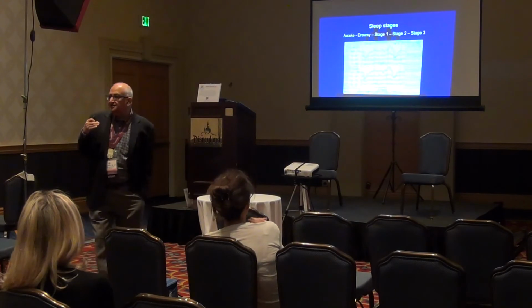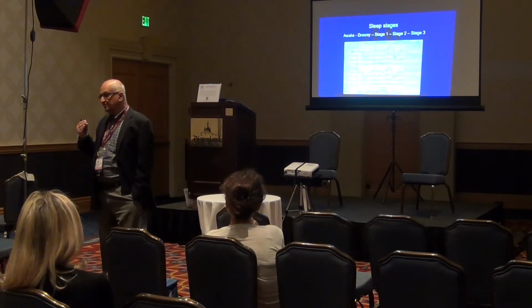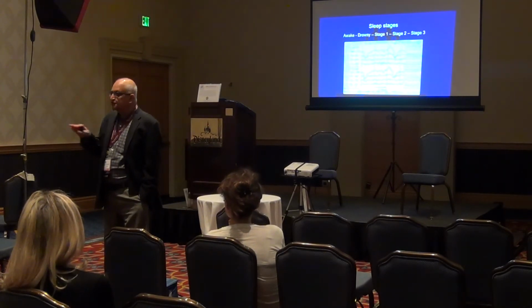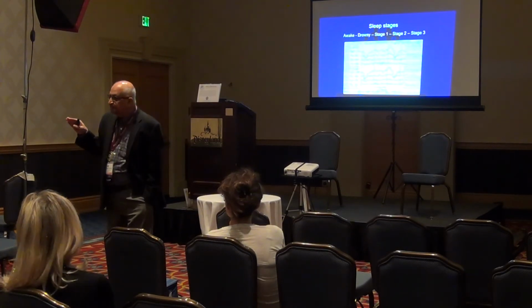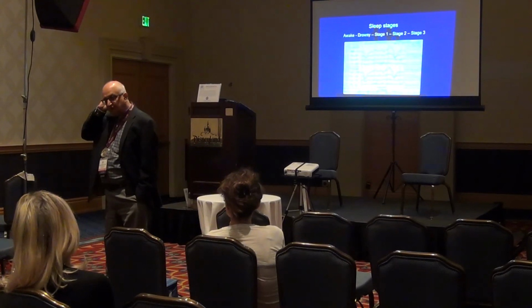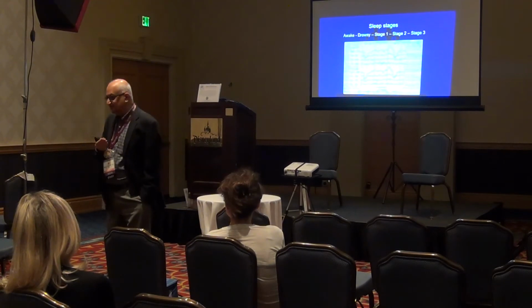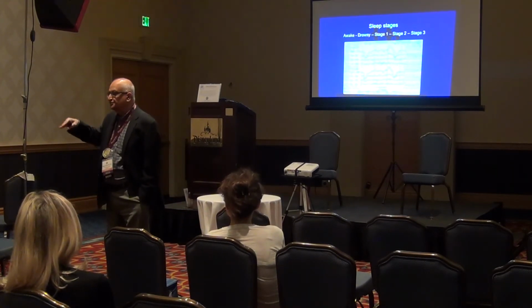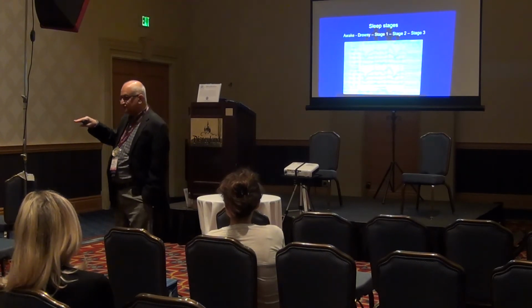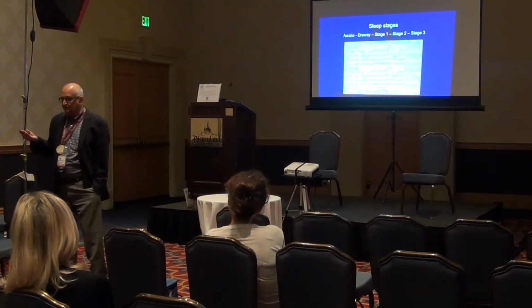Now, what do we mean by reactive? What we mean by reactive is we get it best when they have their eyes closed. They need to be relaxed with their eyes closed. If they open their eyes, it goes away. Why? Because remember I told you it's the idling rhythm. In the back part of the brain, when you open your eyes, it's not idling anymore, it's looking at stuff. So immediately it'll speed up and it'll become flat, right? Because that's what the occipital lobe does. It gets visual information, it's not idling anymore.